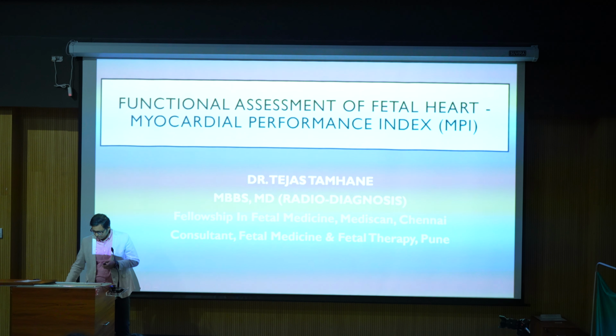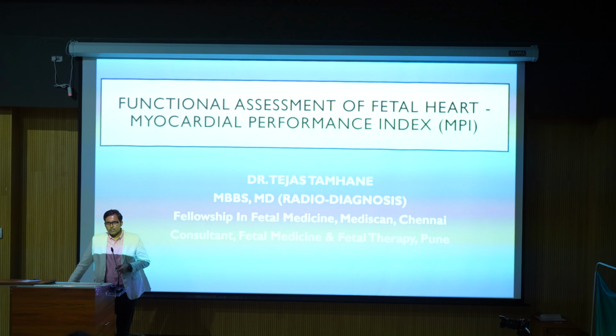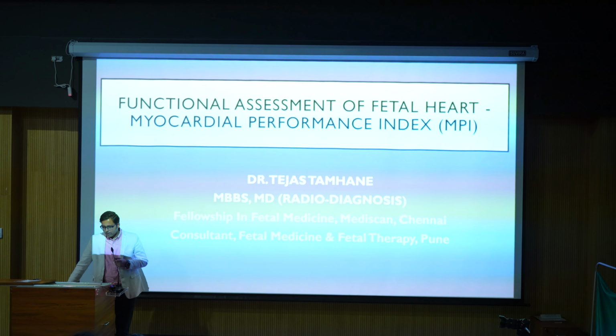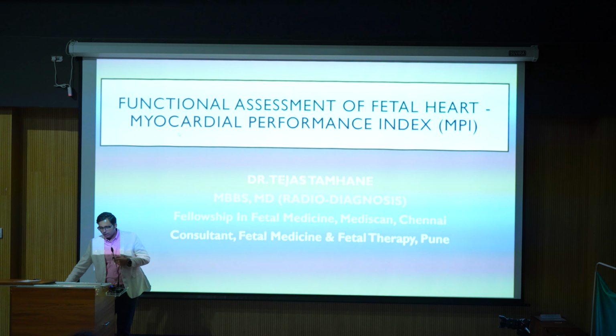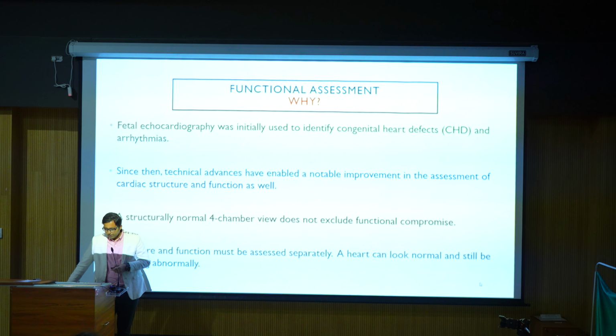the myocardial performance index, but I'll also be touching upon the rest of the parameters based on which we do the functional assessment of the heart. So to start with, why do we need a functional assessment?